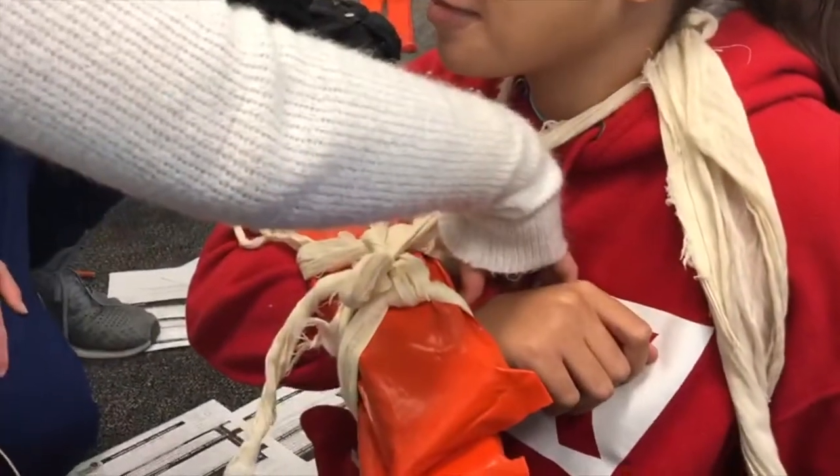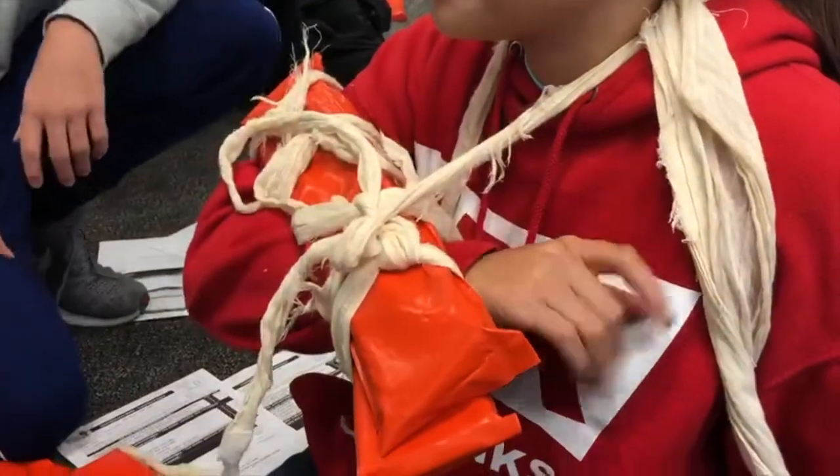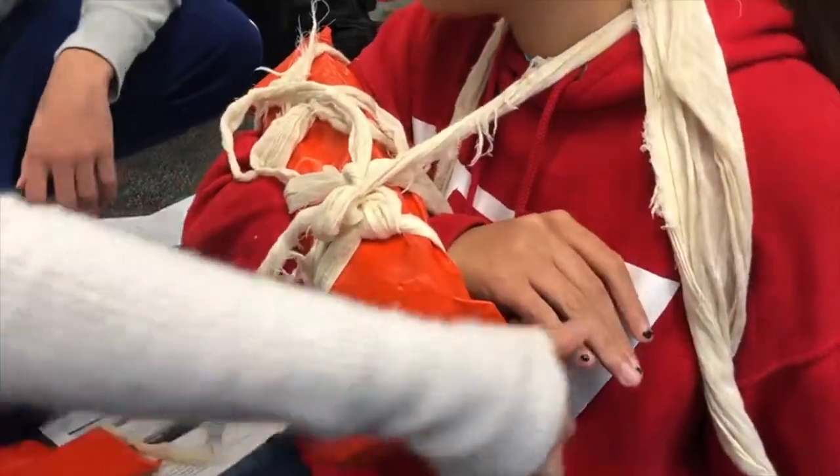And then, don't forget — you have to feel for pulse again. PMS. Pulse. Can you move your fingers? Look away. What finger am I touching? My pinky. Good. And this is for the elbow, right? Yep, this is for the elbow.